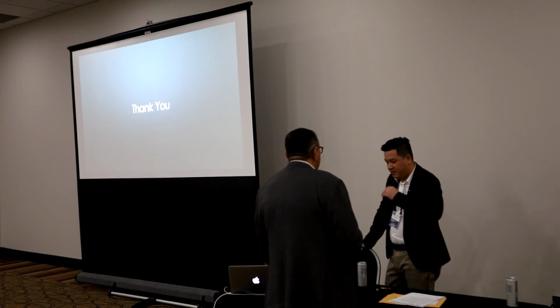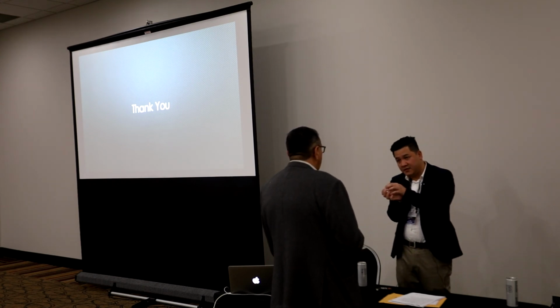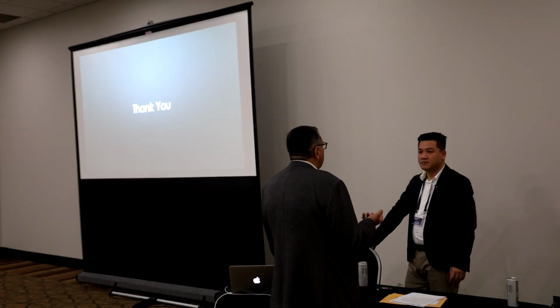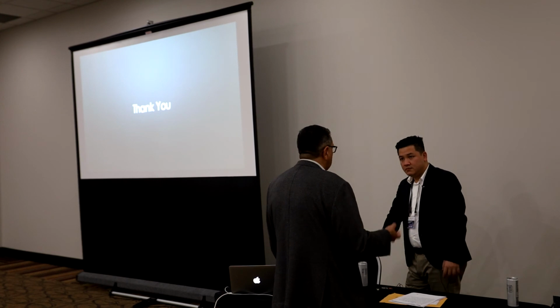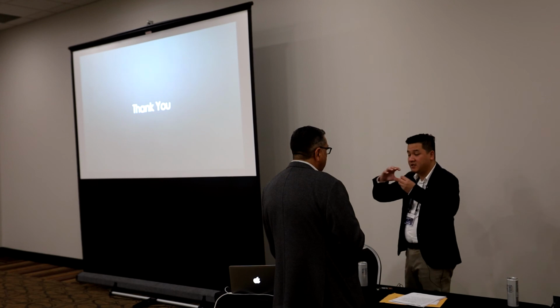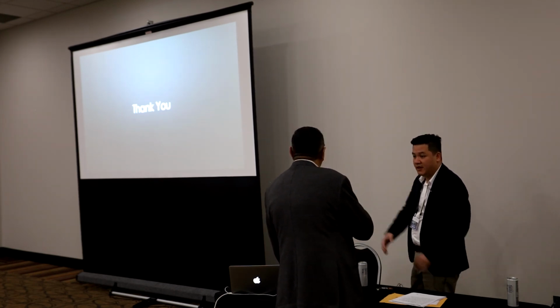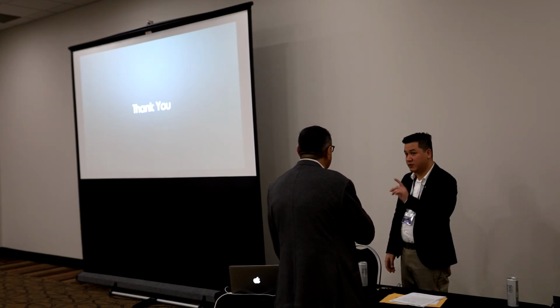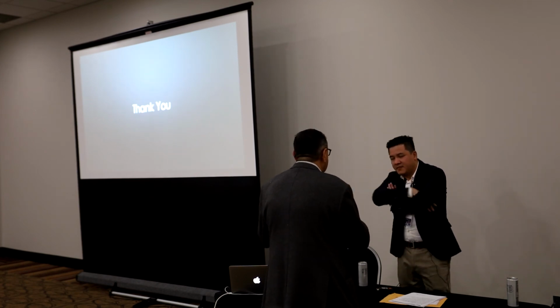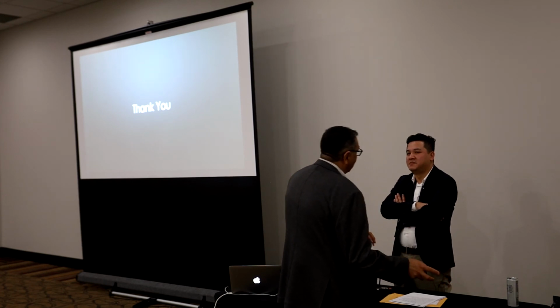So the reason for that is using the hinge articulator check? I use the metal hinge. That's your problem. We have a tooth and use the pen. Yeah, you can use that to check it. But the mounting has to be exactly the same in the CAD software as it is on the model. I have a hard time using the vertical, the 3D articulator, the digital articulator, versus the conventional analog.